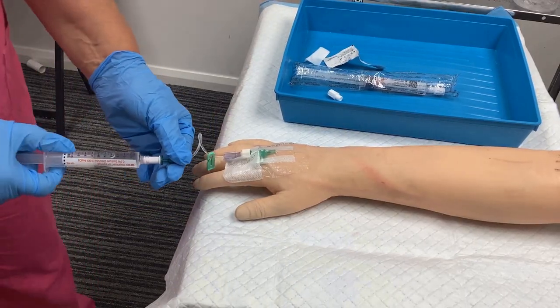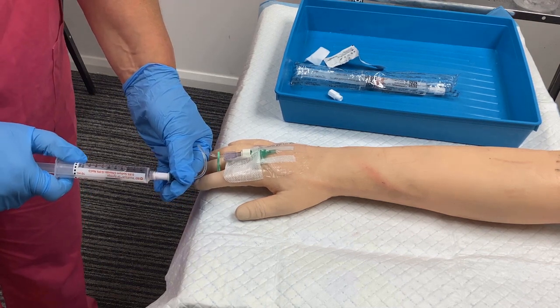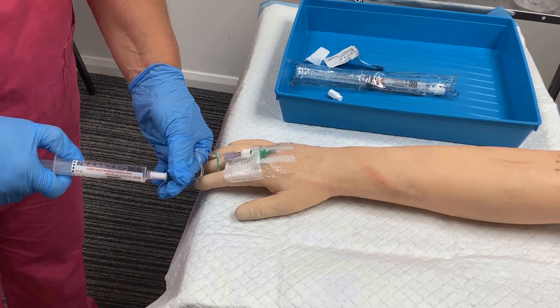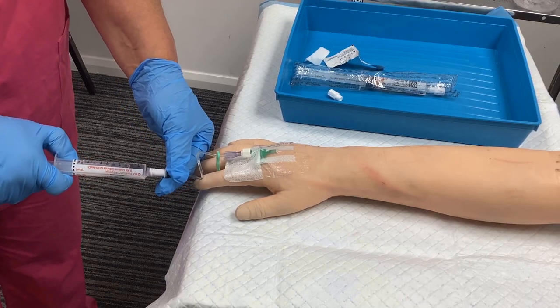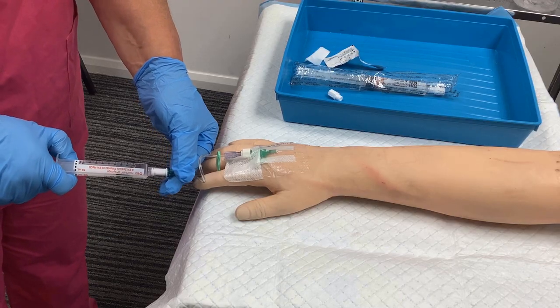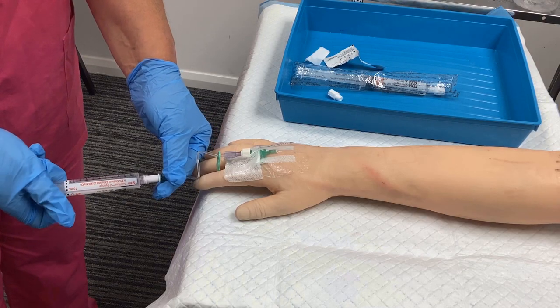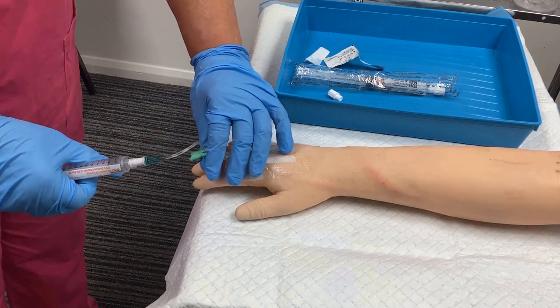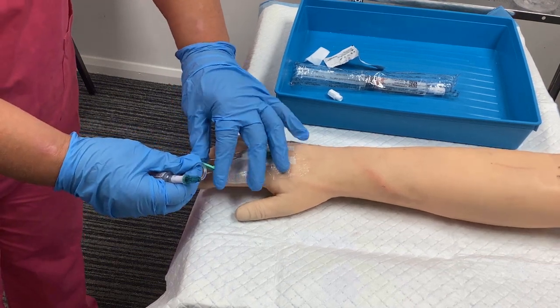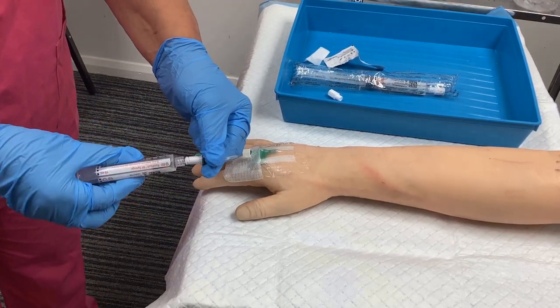And then over the next minute, I'm going to pulsate the 5mls of the saline flush into the vein. So Emma, as I'm pushing that in, can you tell me, does that feel all right? Is there any pain at all? No? Lovely. So it may feel a bit cold, but you shouldn't feel pain. So I'm pulsating it in until all that IV fluid has been given. Before I disconnect it, I'm going to re-clamp that cannula with the clip there. And then I'm going to disconnect the syringe and pop it in my tray there. And then that's all now given.